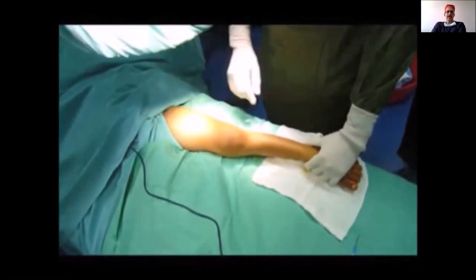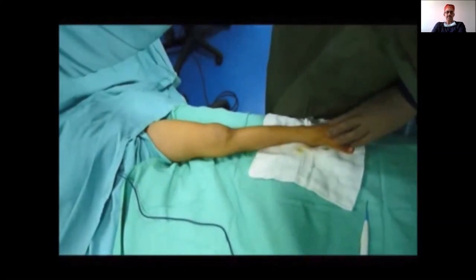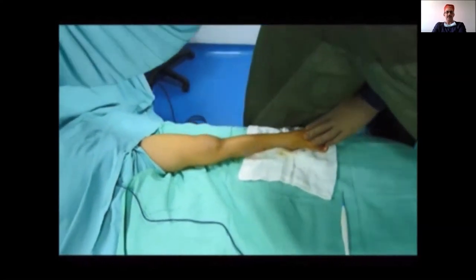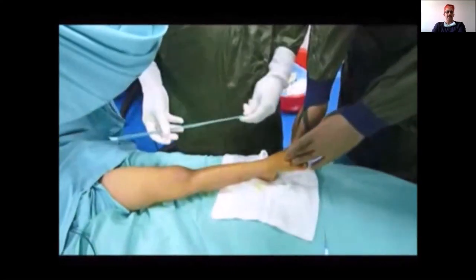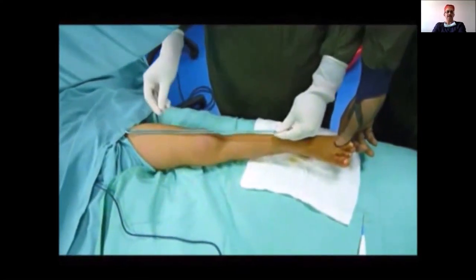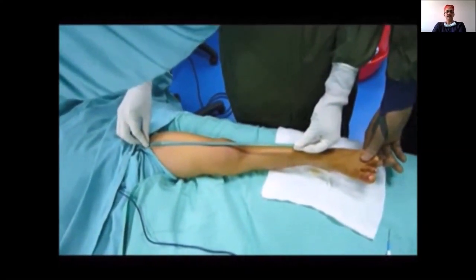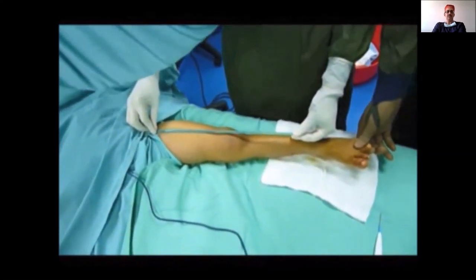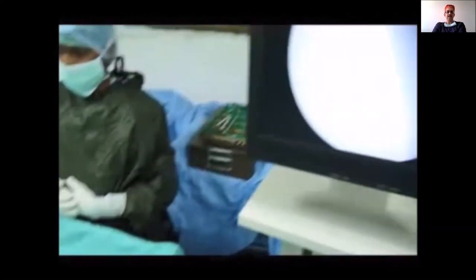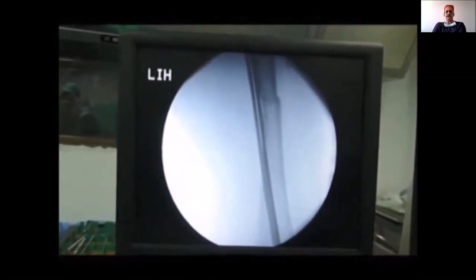The seating points of the nail to form a spindle are the supra-condylar metaphyseal bone and the intertrochanteric metaphyseal bone, such that a spindle forms at the fracture. The diameter of the nail should be chosen such that it occupies 40% of the canal at the isthmus — that is 0.4 times the inner canal diameter at the isthmus. Alternatively, place a couple of nails on the femur to confirm they will occupy 80% of the canal diameter.